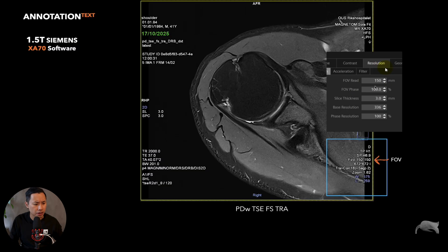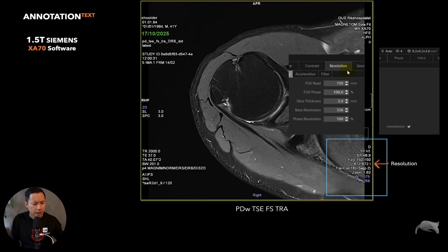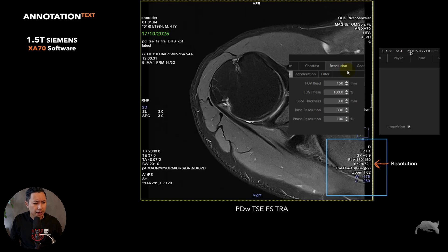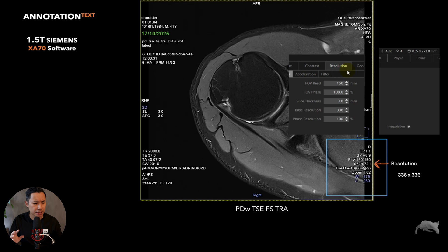In this corner we have the resolution information. The field of view is 150 at fully 100% in all directions - field of view, phase base resolution, and phase resolution - so this makes it easy to do the calculation. It says 'I' there, and 'I' means interpolation - we were using interpolation, which is why the matrix looks very high, like double 336, which is correct. We interpolated to double, giving you the reconstruction matrix. If you move your mouse up to the corner it would also say the reconstruction and acquired values.